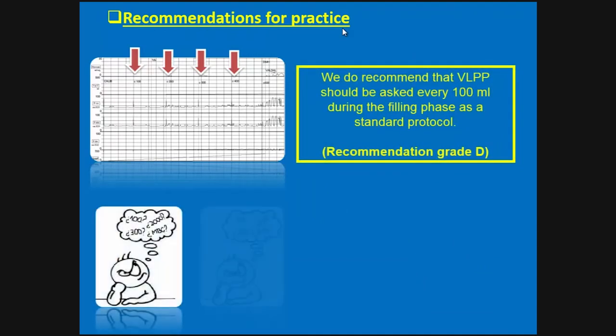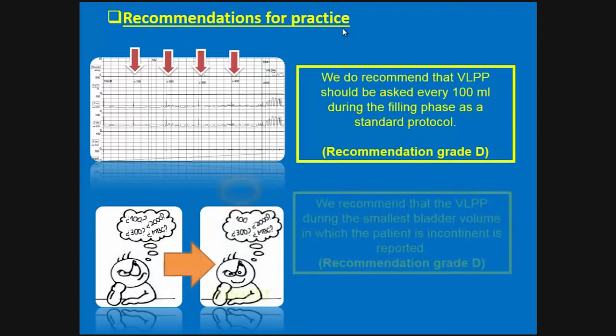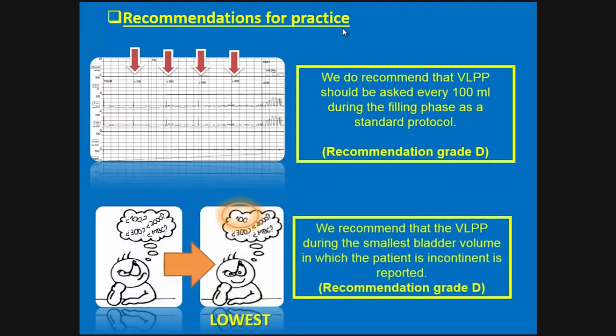Although we don't know the volume at which we have to measure the Valsalva leak point pressure, we recommend that Valsalva leak point pressure should be assessed every 100 milliliters during the filling phase as a standard protocol. And we also recommend that the Valsalva leak point pressure at the smallest bladder volume at which a patient is incontinent should be reported.